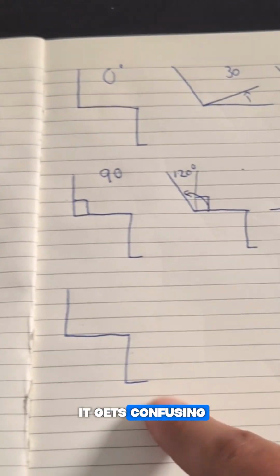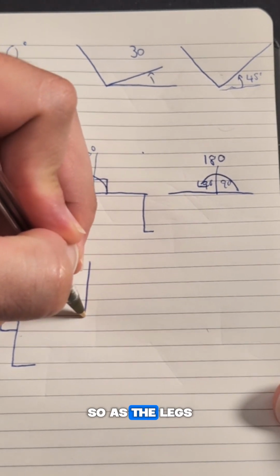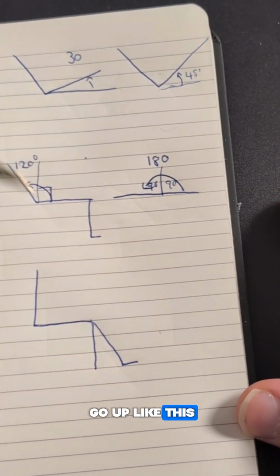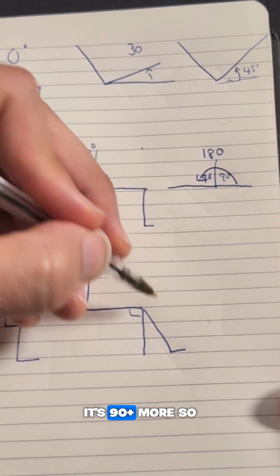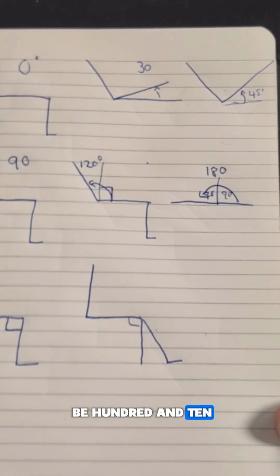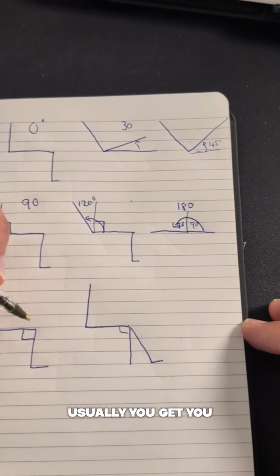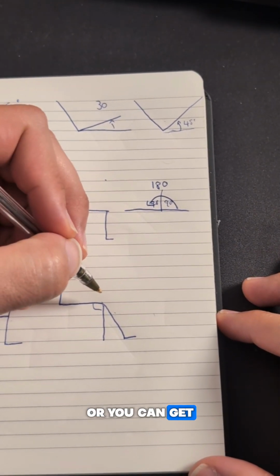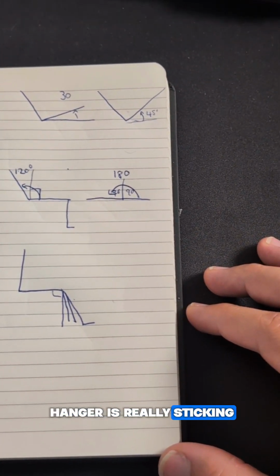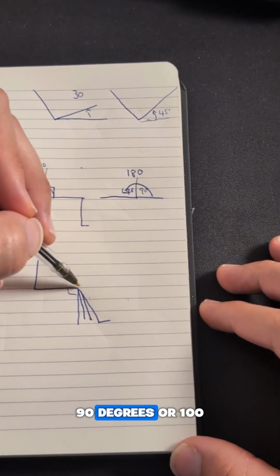Now this is where it gets confusing, because you would think here that this is 90 degrees. So as the legs go up, let's say they go up like this, you would think, oh, it's 90 plus more. So 90, 100, 110. An angled leg rest like this should be 110, but it's not. Let's think about it with manual wheelchairs. Usually you can get the option of a 90 degree hanger, or you can get an 80 degree hanger, or a 70 degree hanger, or a 60 degree hanger is really sticking it out. But that doesn't make any logical sense. It really should be 90 degrees or 100 degrees.